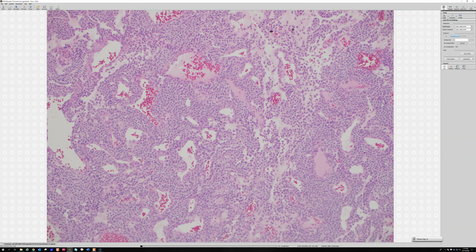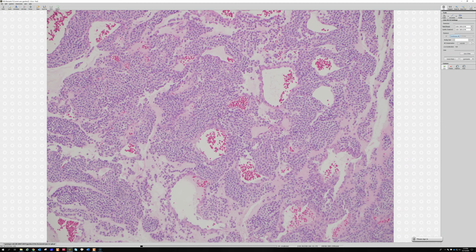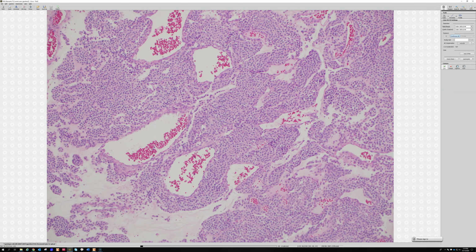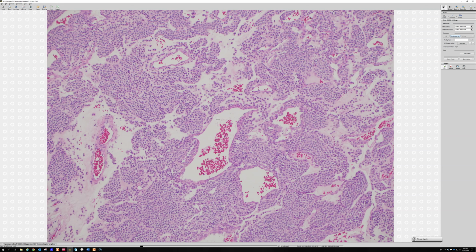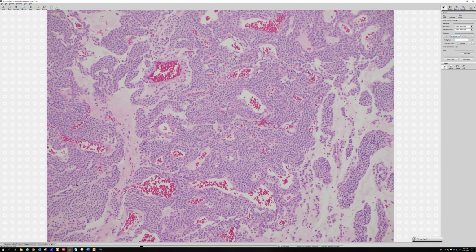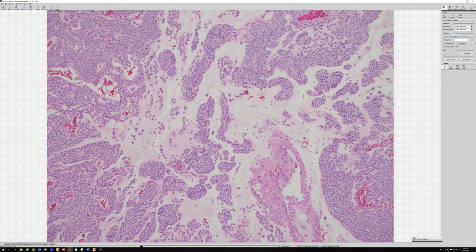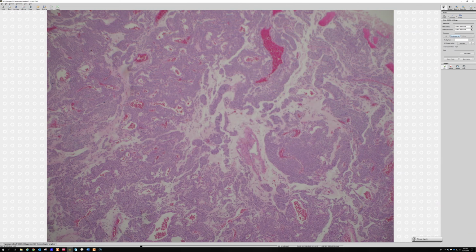And I like your point about that they have halos. You don't always see that, but seeing some degree of pale or clear cytoplasmic change is pretty good for glomus. That can be really helpful. And sometimes it can be prominent and really trick you, make you think it's an epithelial tumor. Like in the skin, they can look a lot like skin adnexal tumors. I've seen cases with a lot of clear cell change that were really tempting to think, oh, maybe it's a hidradenoma or poroid type of tumor. And in fact, it was a glomus. And then also they tend to have a lot of edema or even myxoid change in between the nests of cells. That's not always there, but a lot of times you'll see the cells kind of floating around in this background. So, okay, cool. So this is a big one.